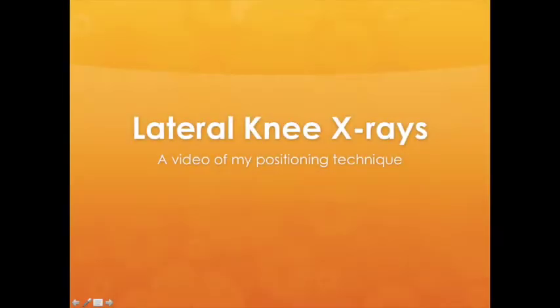This is a video on lateral knee x-rays and in particular a specific example of a positioning technique. This video is intended for student or graduate radiographers who do not have a specific technique themselves. I have found this method works the majority of the time and gives great diagnostic x-rays.